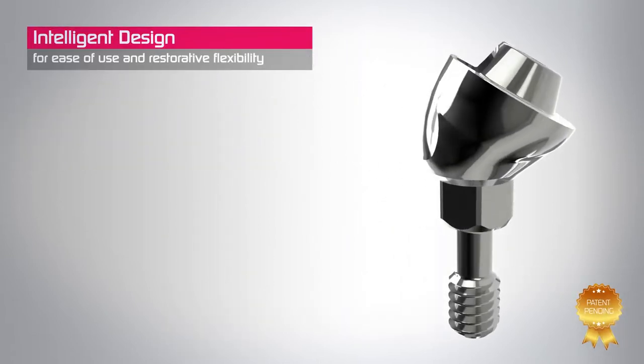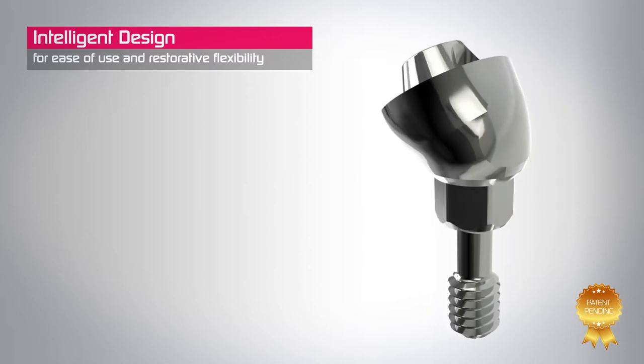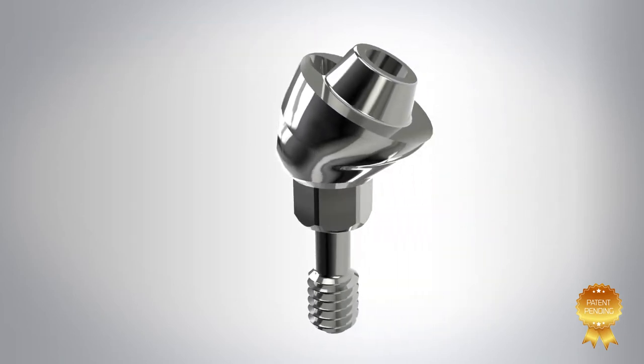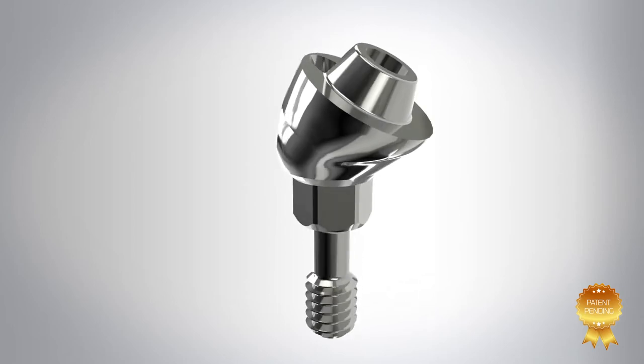Made in one piece, TAG's multi-unit abutments feature a reduced size to improve the aesthetic restoration. We provide a complete range of insertion angles and heights for all your patient's needs.